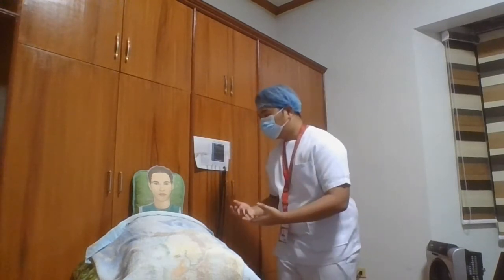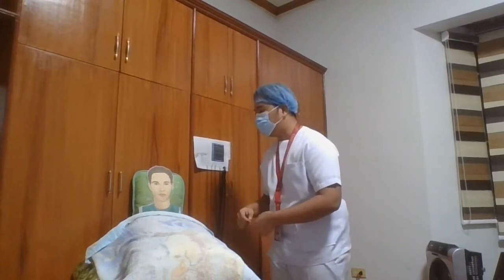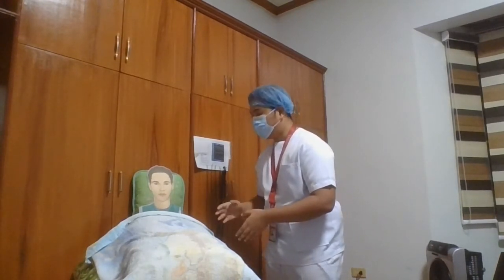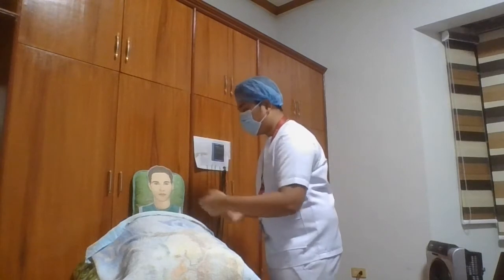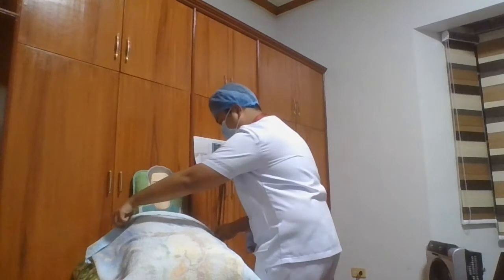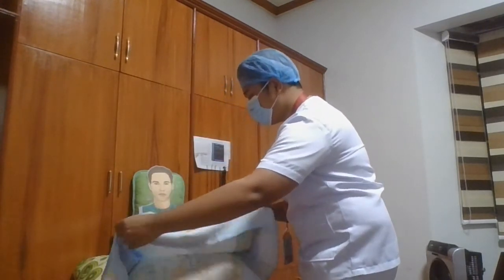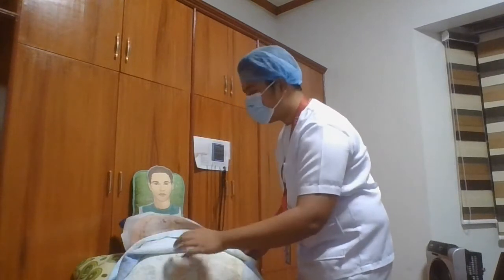However, we will keep the pelvis and the thighs covered. Sir, I'm going to help you in exposing the area for the ECG, which is your chest and then your arms. Is that okay, sir? And then if it is okay, we're going to assist him, only exposing the chest and the arms while still covering the thighs and the pelvis.